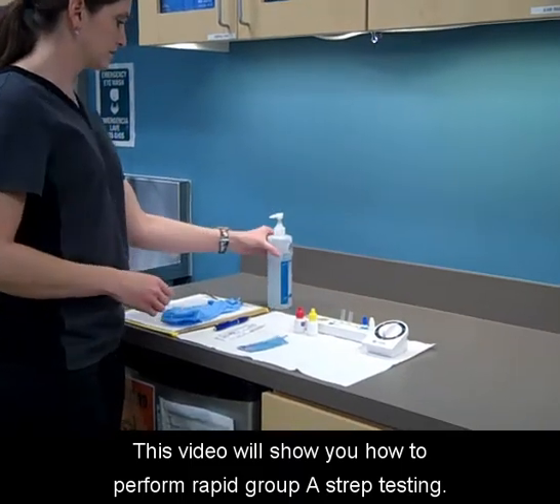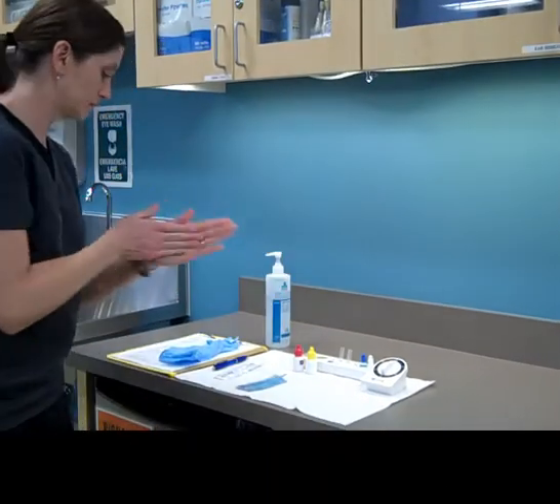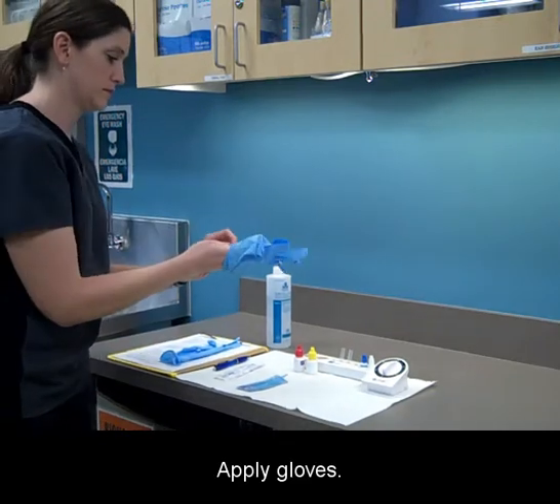This video will show you how to perform rapid group A strep testing. Wash your hands and apply gloves.